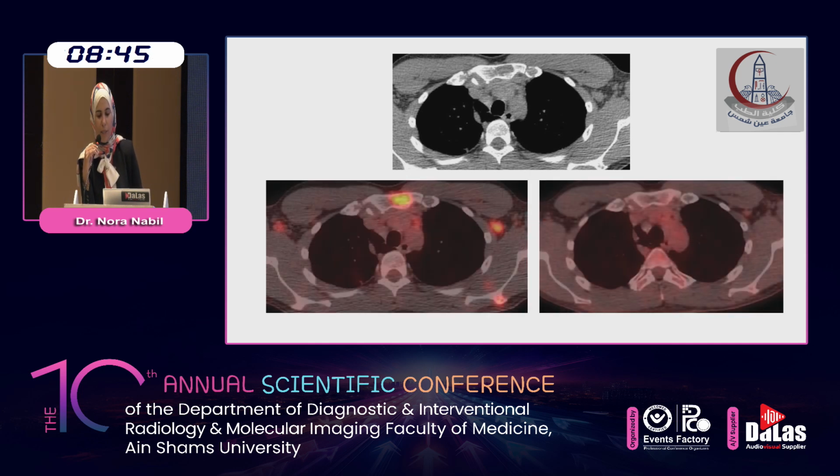Systemic sarcoidosis in a 35-year-old woman. On the axial CT image, it's difficult to assess involvement of the bones and non-enlarged lymph nodes. In B, axial pre-treatment fused FDG PET-CT shows hypermetabolic lesions in the sternum, in the clavicle, in the lymph nodes here, and in the axillary lymph nodes. After treatment, fused FDG scan shows near complete resolution of these hypermetabolic foci.